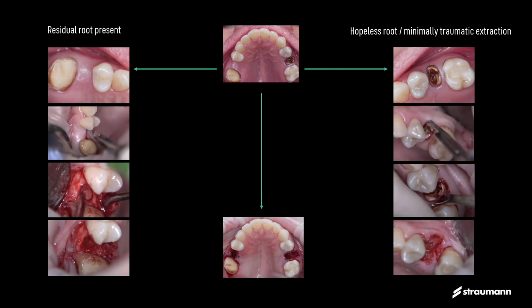So you see on the number 15, as I told you, there will be a surprise. On the CBCT, I noticed, even though it looks like a healed site, there was a residual root trapped underneath that soft tissue. The tissue looks pretty good, but there was a residual root there. So in that case, I made a crestal incision, I opened the flap, and then I started with the procedure to remove that root out.